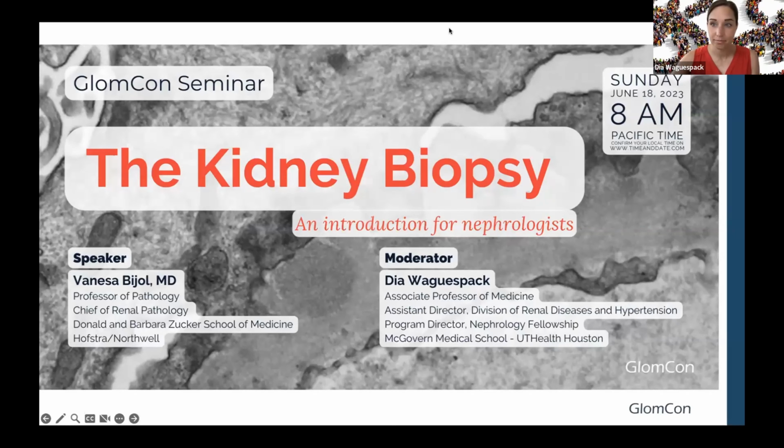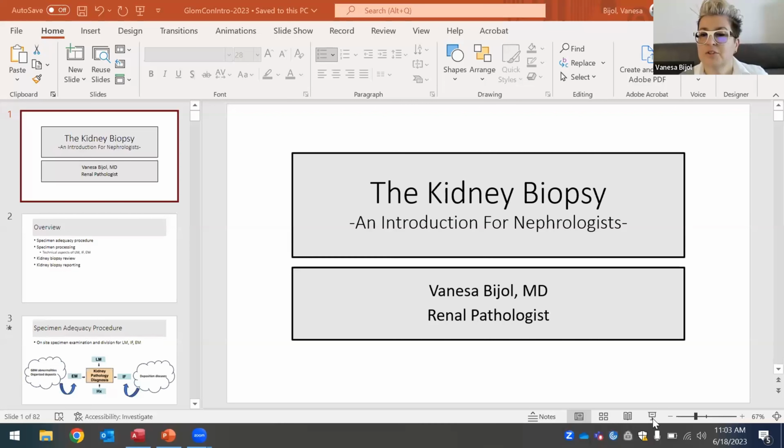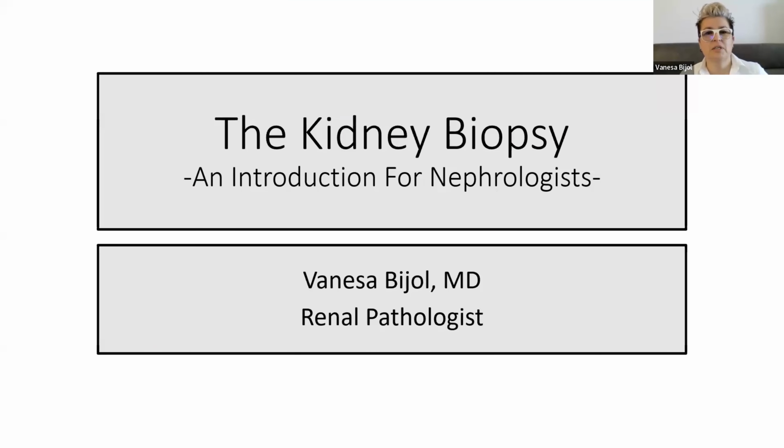I'm gonna share my screen. And as I'm doing that, I'm just going to say, I was asked to give this talk on basic kidney biopsy for nephrologists. So this is a talk from a renal pathologist to the nephrology community. And I do see that we have some renal pathologists in the audience. So this talk is probably very basic for you, but please feel free to chime in as I go.